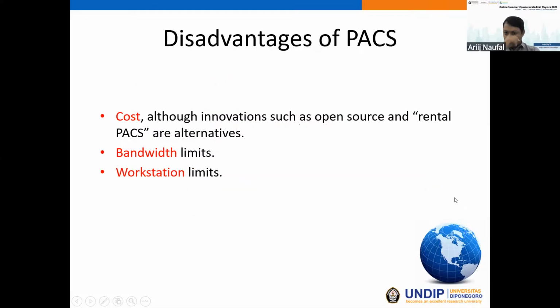However, PACS also comes with some disadvantages, which are mainly the cost. Most PACS, I mean fully operated PACS in a hospital, is very expensive. It's an expensive project. Although innovations such as open source and rental PACS can be alternatives to minimize the cost.